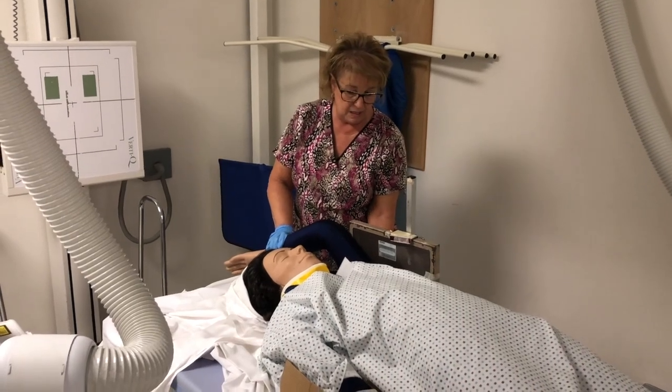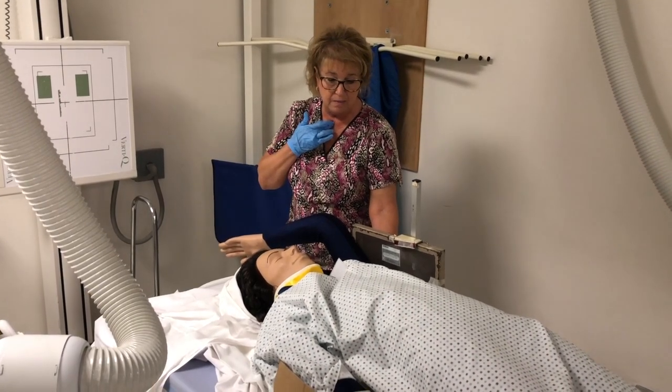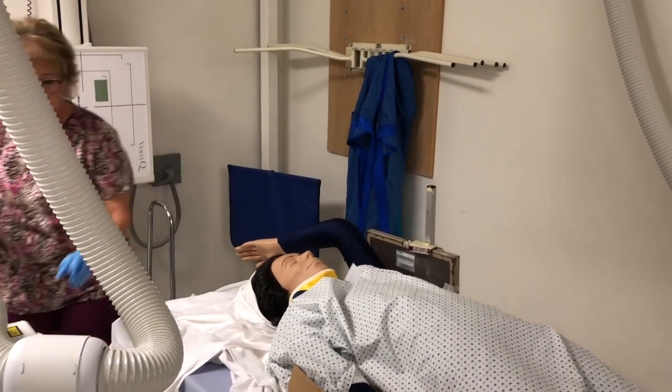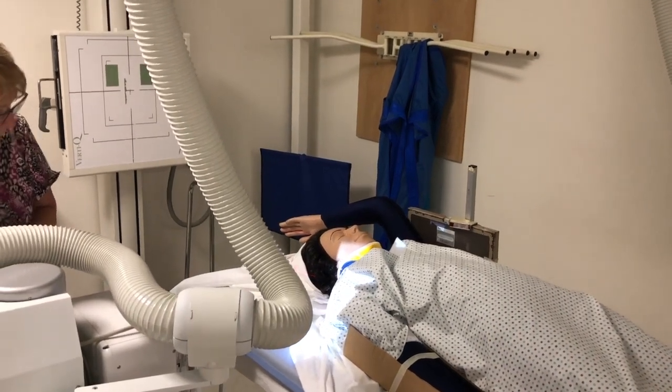So in this case, I would elevate her uninjured side. I would move the center of my IR now down to the level of the sternal notch, which is around C7, T1. This can be done at 40 inches. Okay.